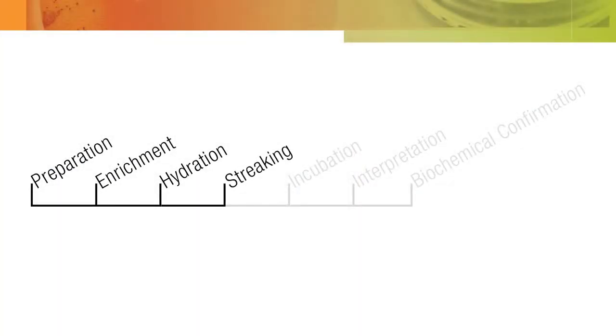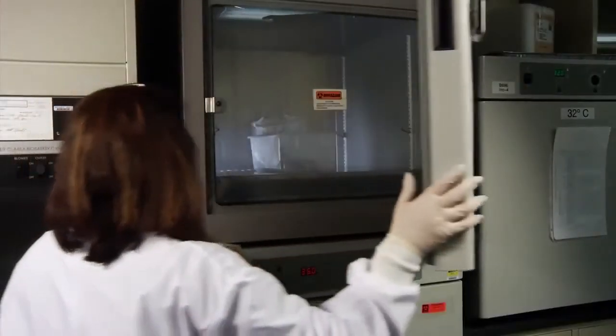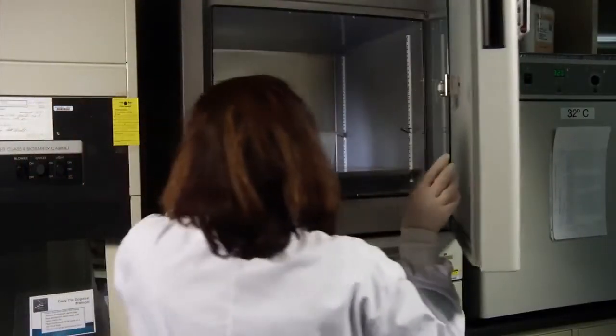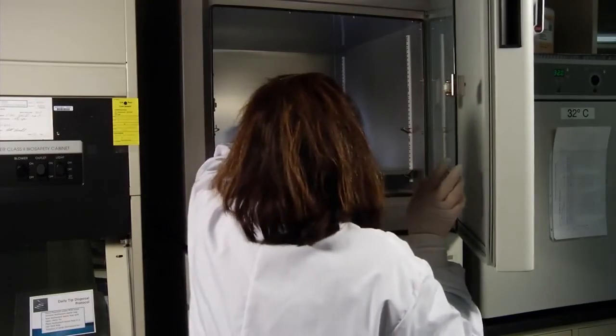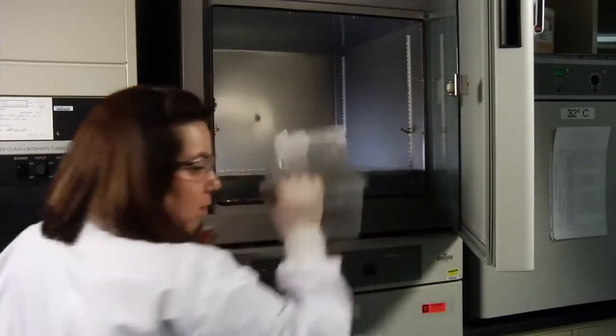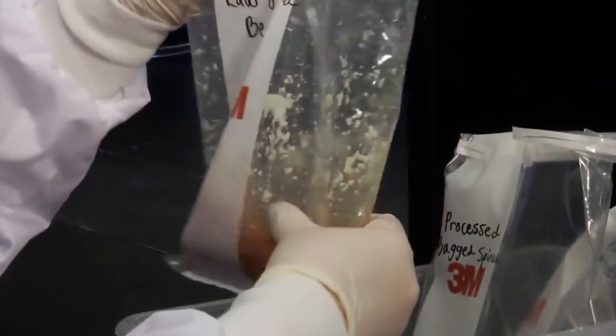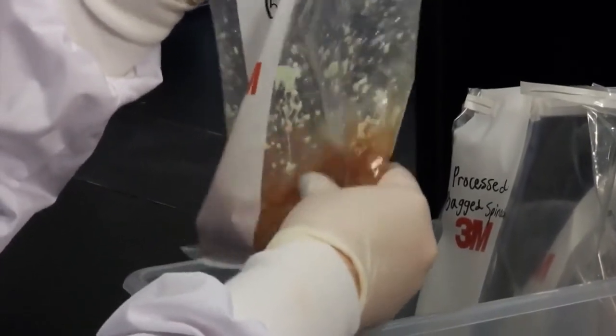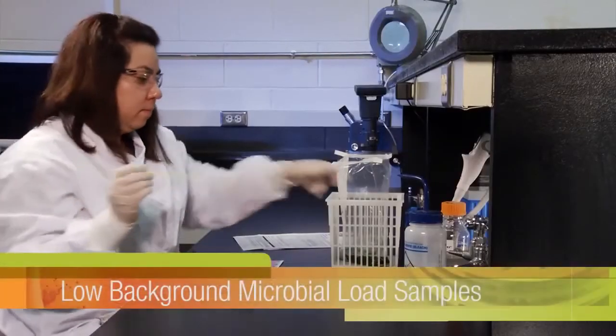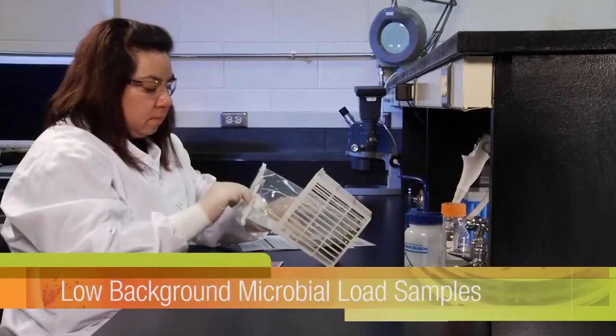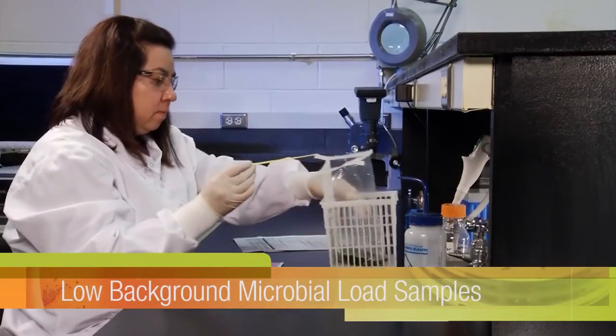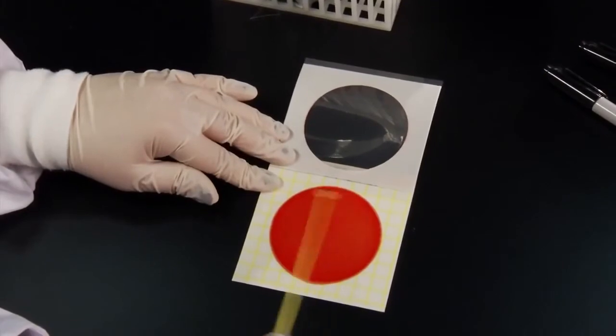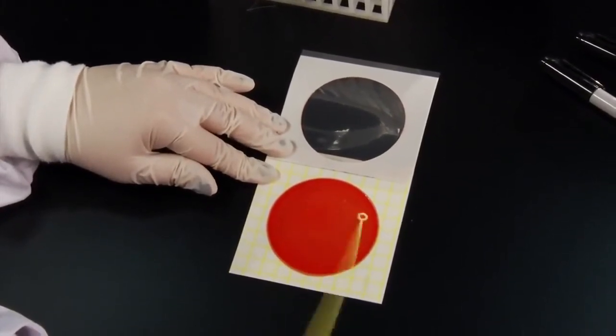The next step is streaking your enriched product samples onto the pre-hydrated 3M Petrifilm Salmonella express plate. Remove the enrichment medium from the incubator after the required incubation period and agitate its contents by hand. For low background microbial load samples, proceed directly with streaking the enriched sample onto a hydrated plate.